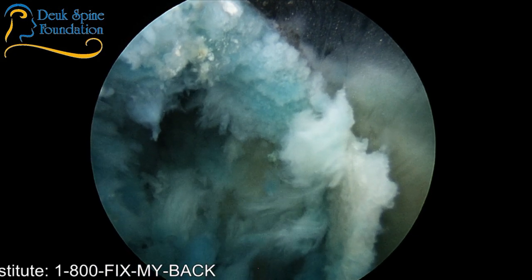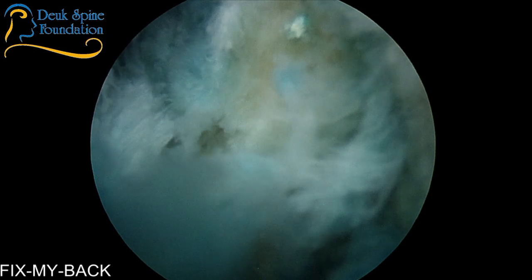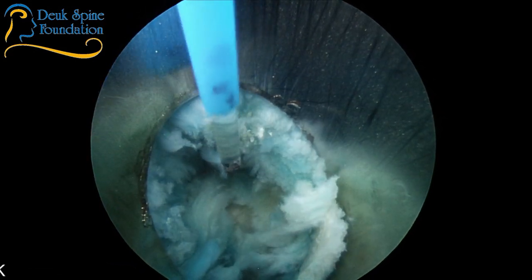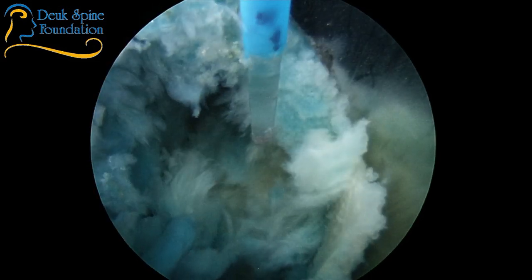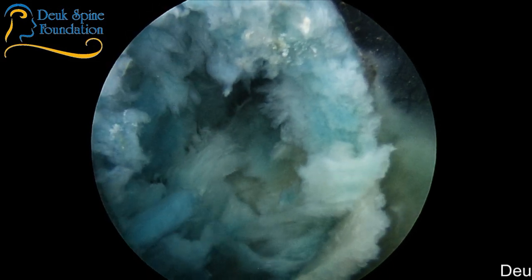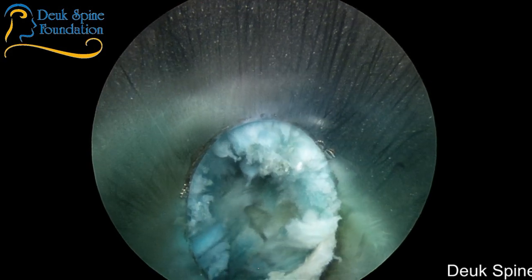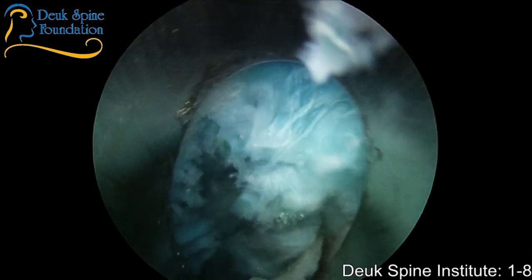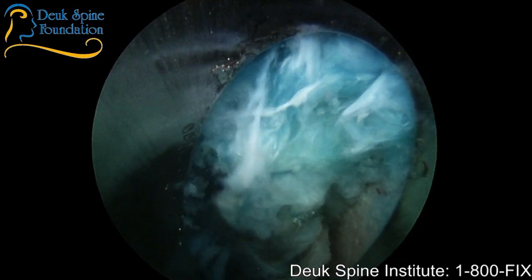Standby laser. Wipe. Are you able to see, Luis? Yes, sir. Okay. All right. Man, I'm up against his rib cage. That's how high. I'm just amazed at the anatomical constraints. So a big tear right there.